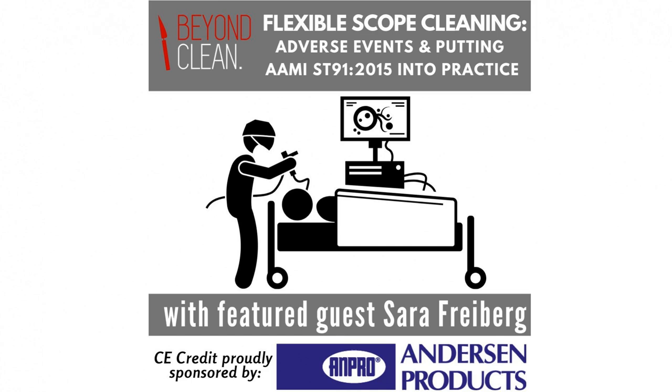What are some common errors related to improper leak testing? What's the impact on the scope and other factors? Some users depend on their facility's automated endoscope reprocessor, AER, to perform that leak test, because that is what they say they were told, that the unit can perform the leak test.